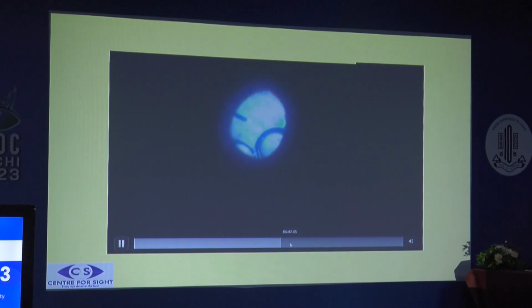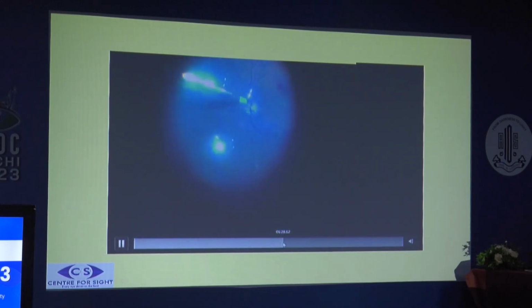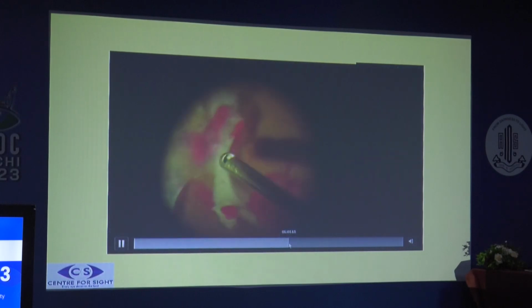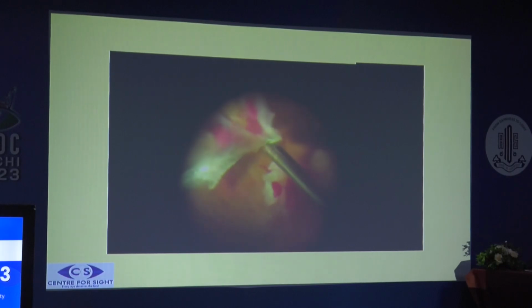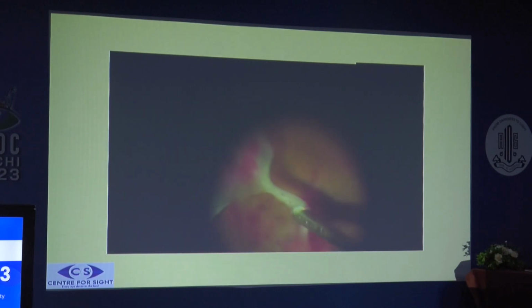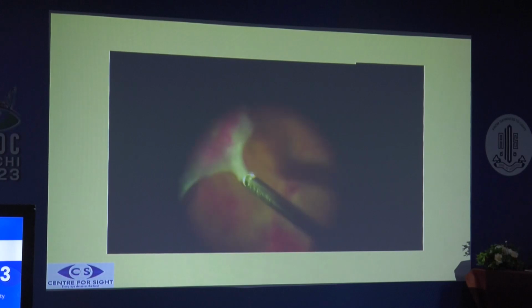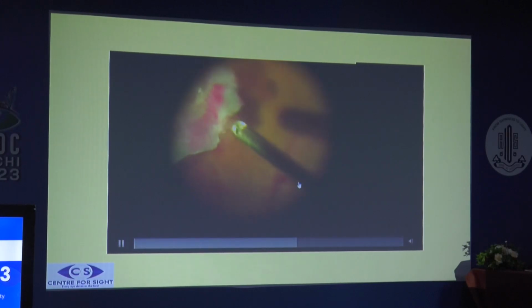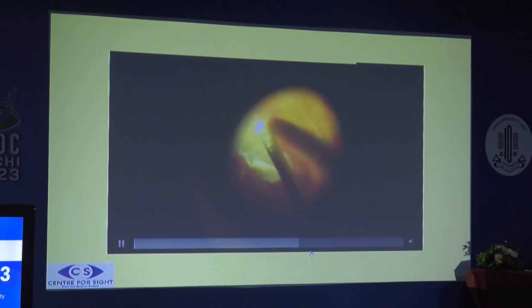Here we did peel the ILM in this patient because this is a tractional kind of diabetic. This is another patient who was undergoing vitrectomy for a TRD. Here the reason I am showing this is there is a dense cord. Although the macula is very good, initially I thought it would be difficult because it is so thick, but ultimately with the cutter and suction alone, we could remove this. I did not take it to the entire periphery. I just truncated it and then diathermized the edges of this, and then did the air fluid exchange.